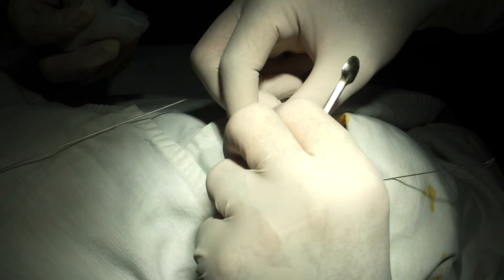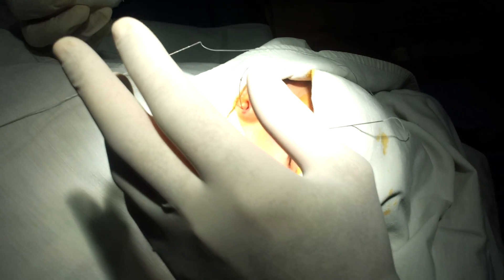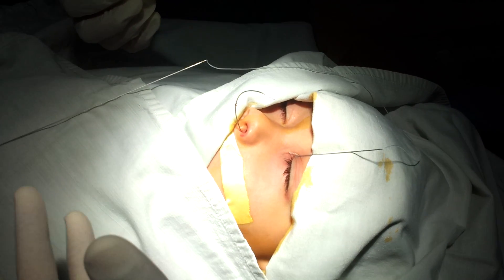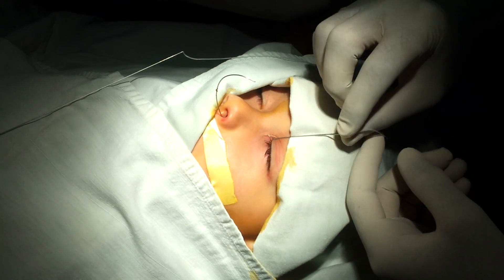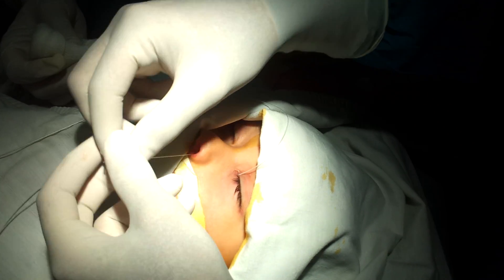Minimal trauma to the nasal mucosa. Then you put some ointment on the junction between the silicone tube and the guiding wire, and you pull it out — and here you go.